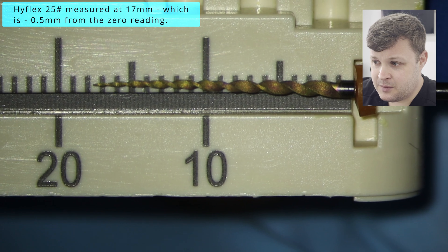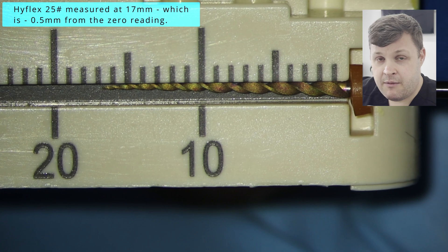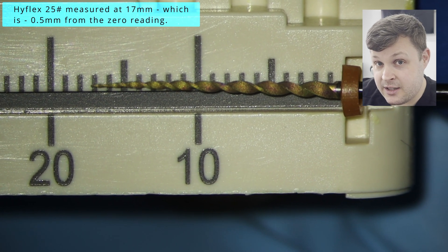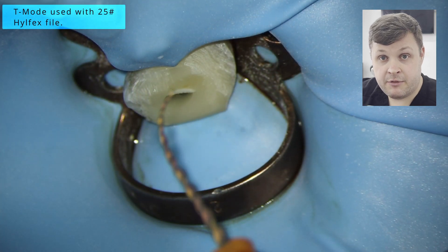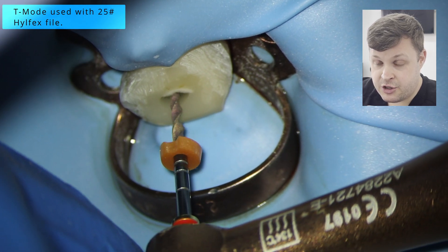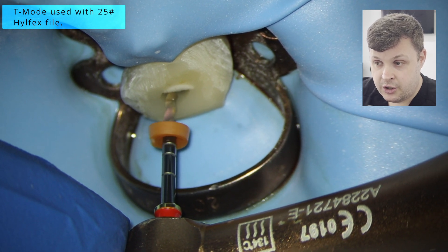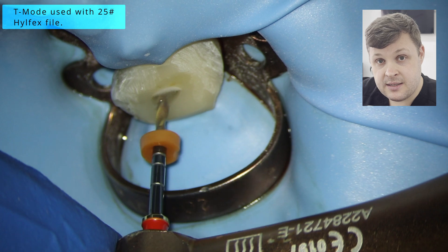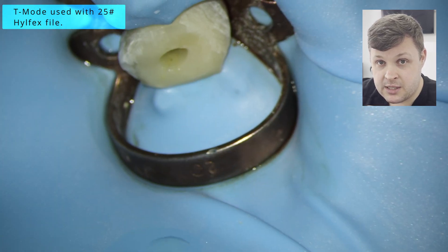I decided to go straight up to a size 25 High Flex. I was pretty confident that the ledge — or whatever was happening at the apex, I didn't know it was an apical split at this point — was carefully negotiated. I'm using this size 25 High Flex at minus 0.5 millimeters from the zero reading. The great thing about these High Flex files is they have shape memory, so I can just make a little bend at the end and use T mode watch-winding motion to skip past the so-called ledge — which is actually an apical split. Once we reach past, press the button again and you get a nice rotary action that shapes it all nicely out.